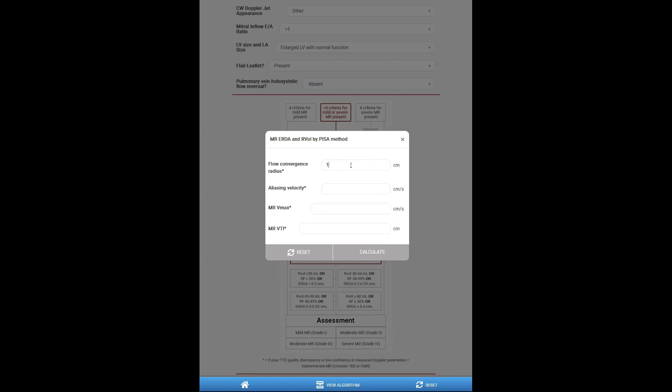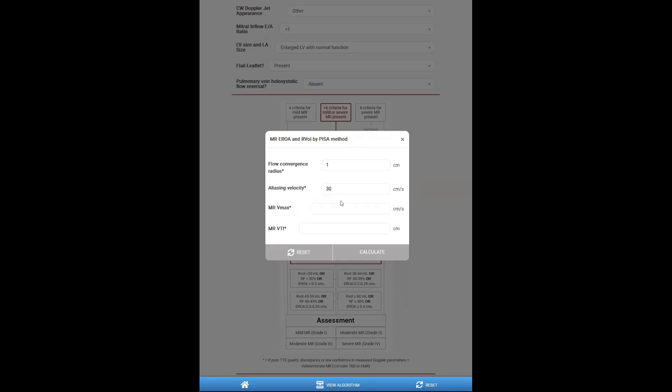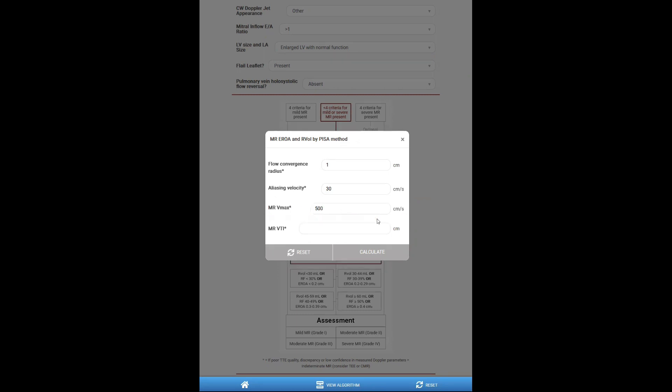So I can enter some parameters. And notice this method. If, for example, I enter five, because I'm thinking meters per second, instead of centimeters per second, and it's something that's completely outside of what the calculator is expecting, there are some guardrails in place that will warn the user in case there is a typo or any such error.